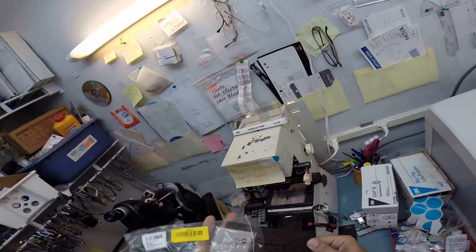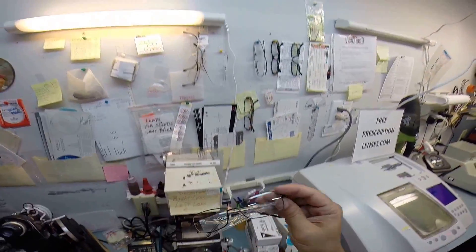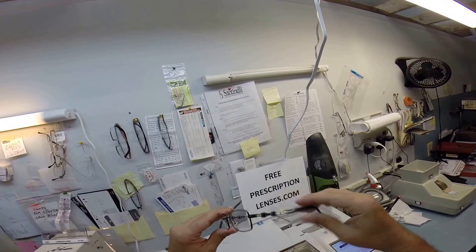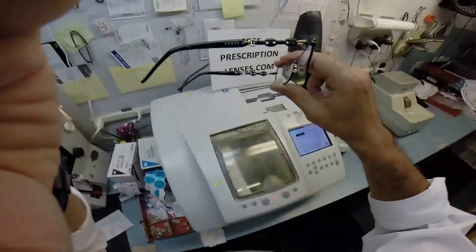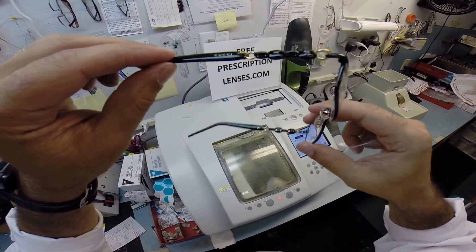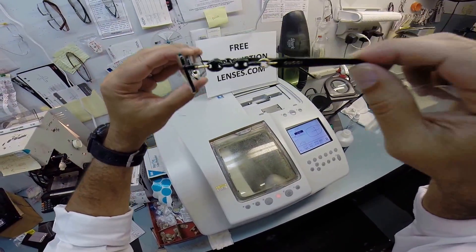Let me take everything out. This is the original packaging that Gucci sends them to me in. This is your Gucci case, your Gucci cloth, and of course your Gucci shiny black and gold frame. Beautiful frame with their classic chained — it's like the links of a chain — their logo in that.